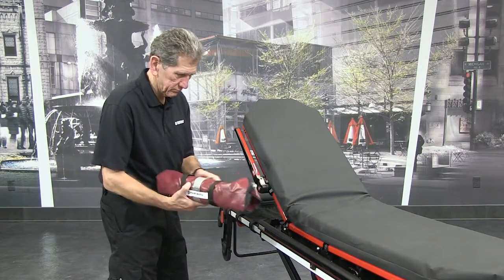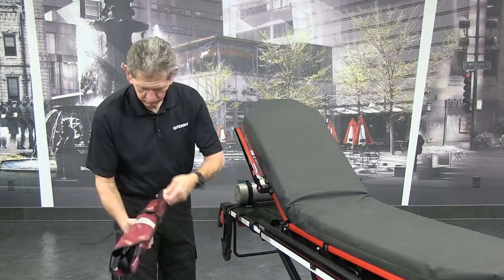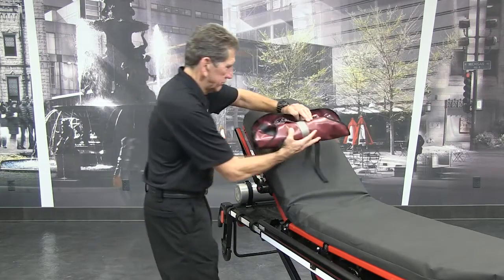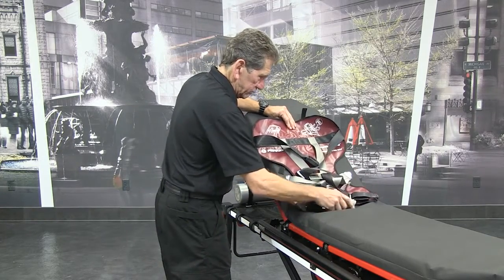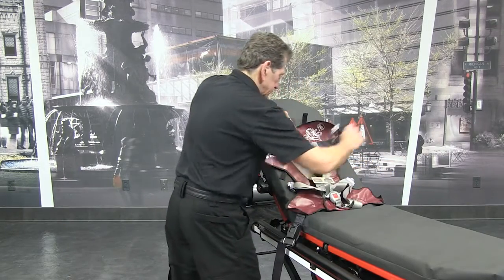Unroll the PDMATE and spread it flat on the cot mattress and extend the straps. Center the PDMATE left to right and position it with the black backrest strap at the point where you expect the patient's shoulders to rest.